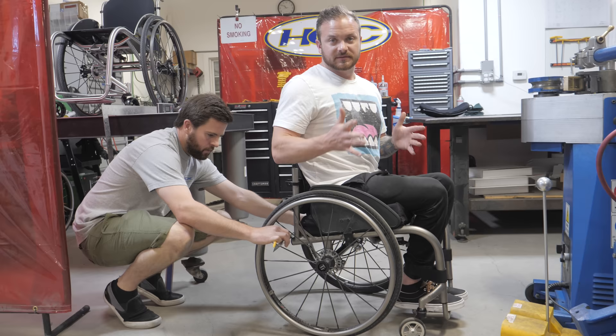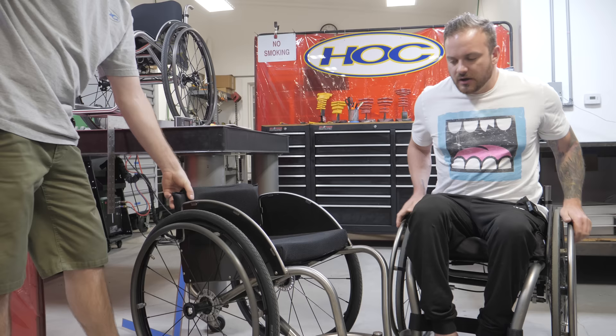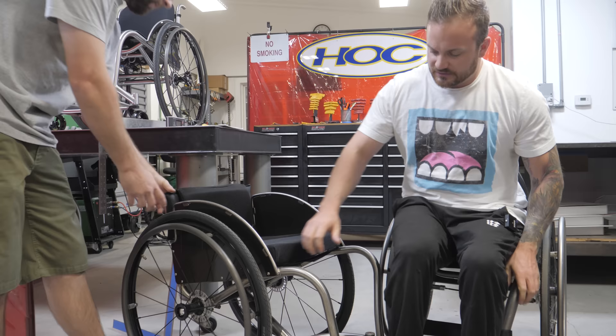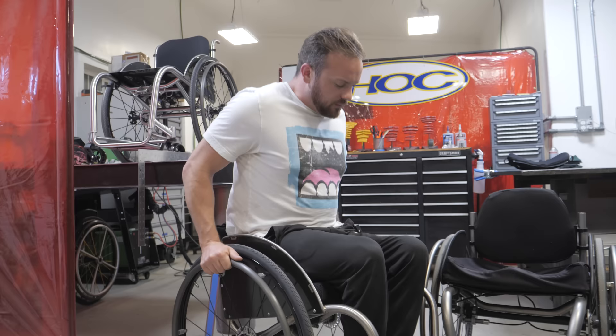One of my gripes was that I had a chair that I felt was a little too wide. They actually happen to have a chair that's a little bit smaller, so I'm going to jump into it and see how I like it. When you are a newly injured wheelchair user going to the seating clinic for the first time, sometimes they will intentionally put you in a chair a little bit wider than you need because they believe you're going to put on weight from being inactive. That wasn't my case — I stayed about the same weight and I was really frustrated because my chair was bigger than it should have been.